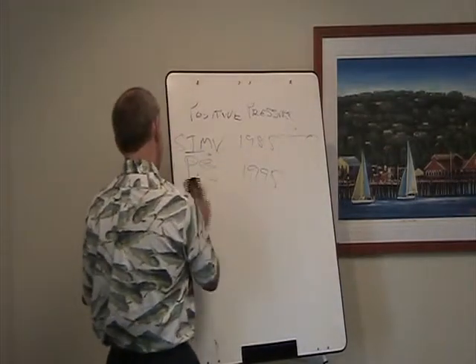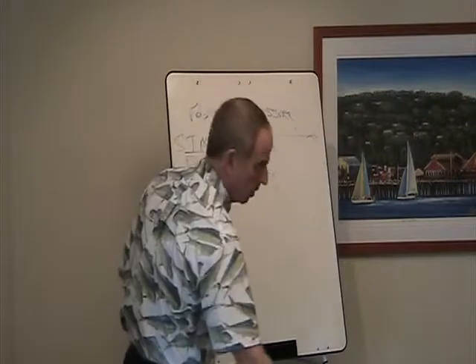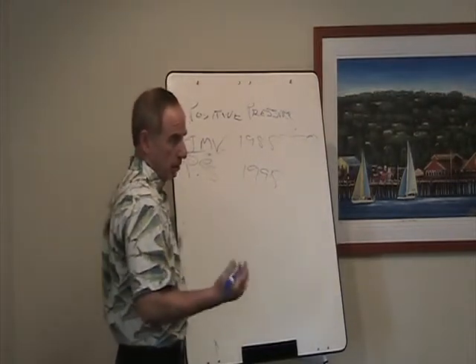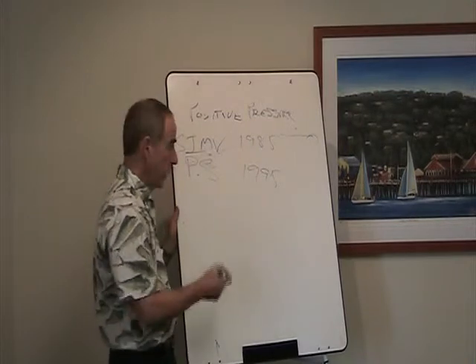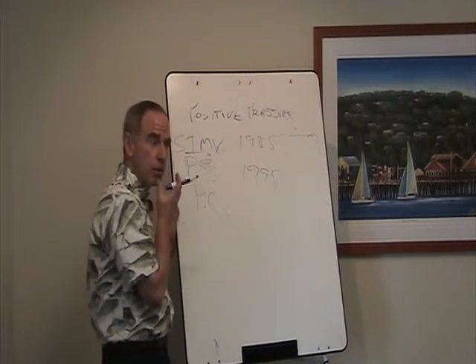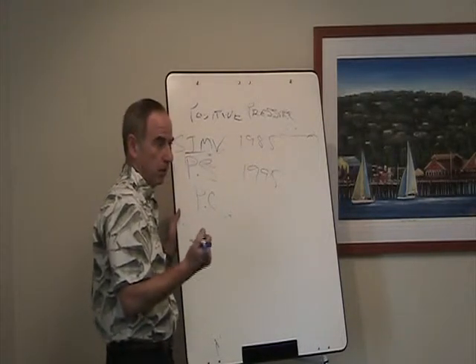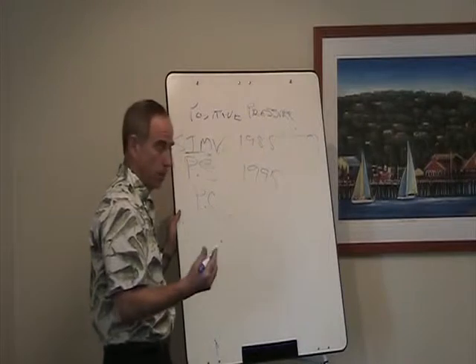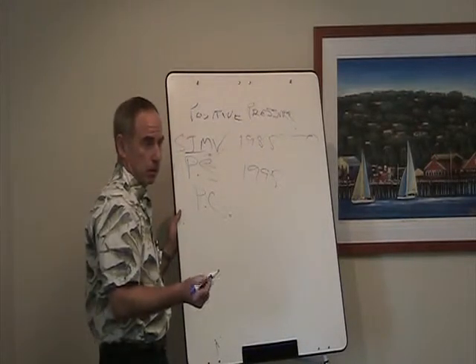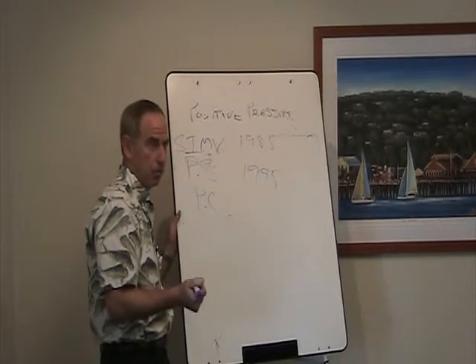All right, also in probably the late 80s, early 90s, there were other modes of ventilation starting to be developed and tested and used, okay? One of them is pressure control, okay? So pressure control is a pressure limited form of breathing, just like pressure support, but what's the difference? Anybody have any idea? How is pressure control different than pressure support?